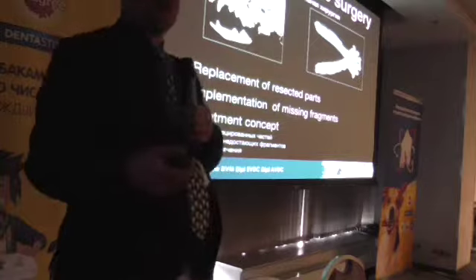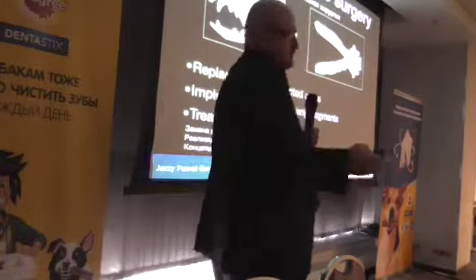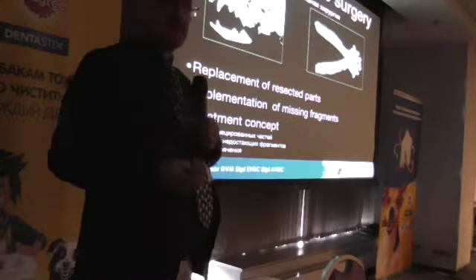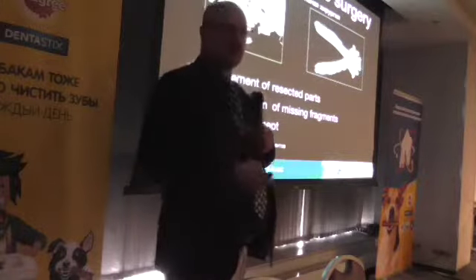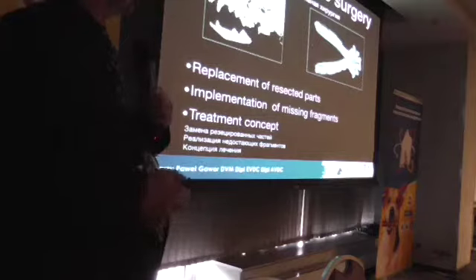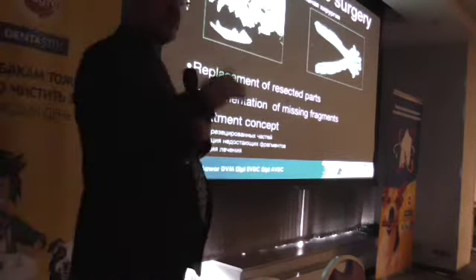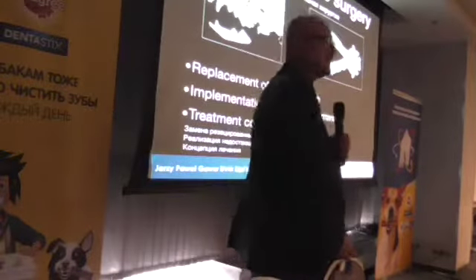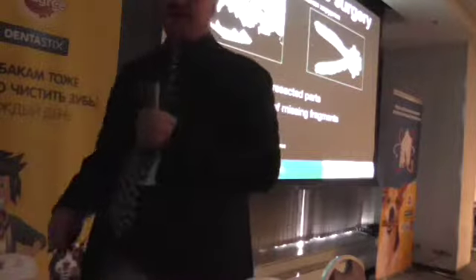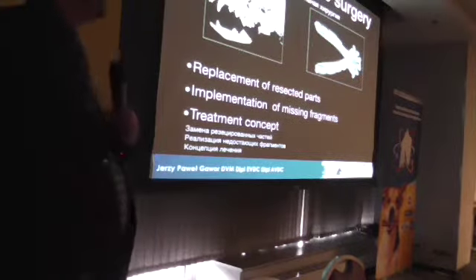So reconstructive surgery, just as an example, we do that because the owners in more and more situations really want to implement some kind of reconstructive prosthetic solutions. So on the left there is a dog with a missing fragment of mandible after several attempts of stabilization with the screws, pins, plates, and the surgeons only destroyed the mandible.